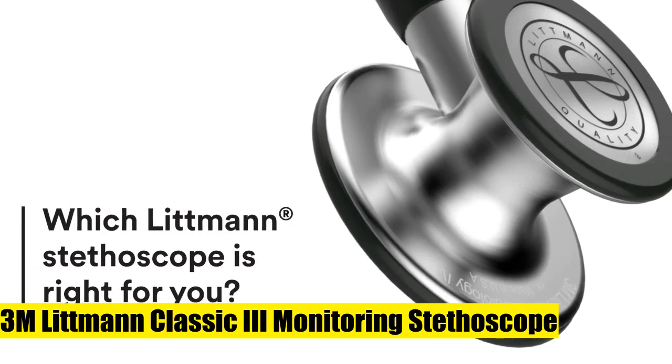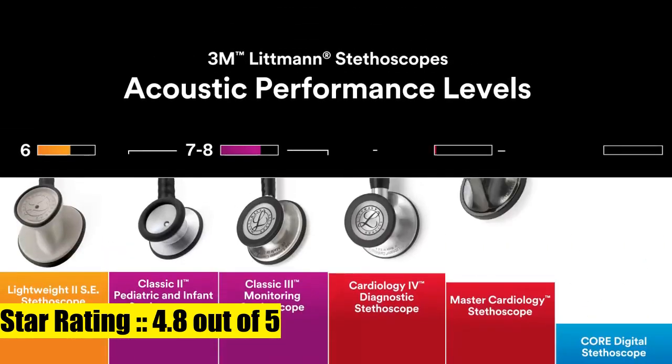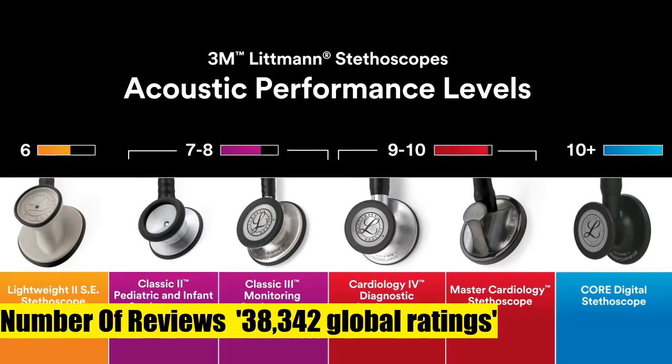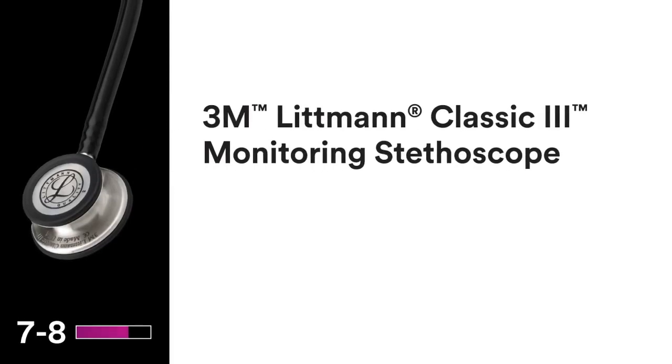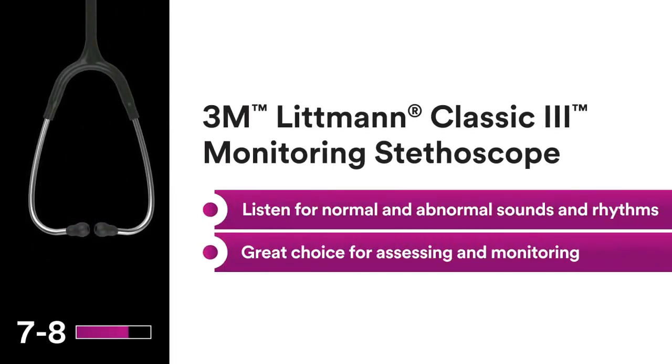3M Littmann Classic 3 Monitoring Stethoscope, Black Tube, 27-inch. Monitor and assess a wide range of patients; detect normal and abnormal sounds and rhythms. Useful in non-critical care environments such as a medical office, general ward, OB/GYN.